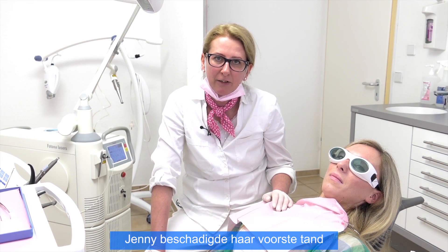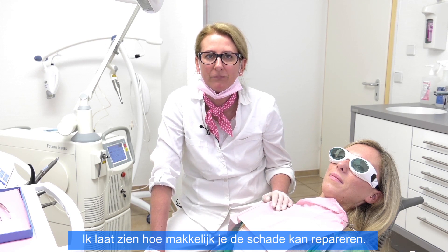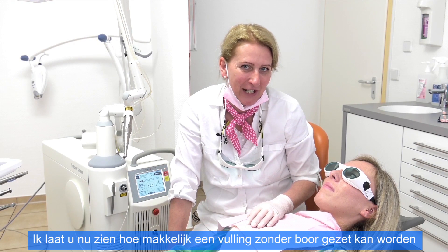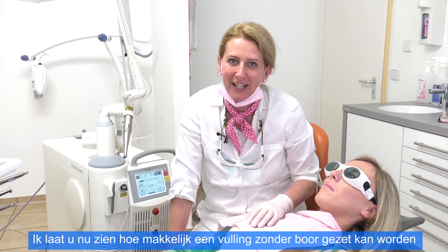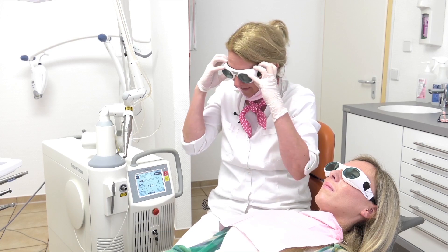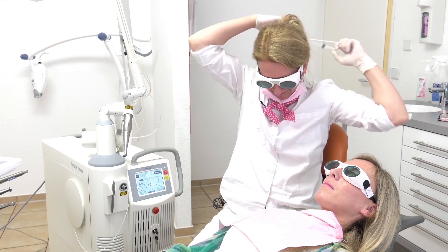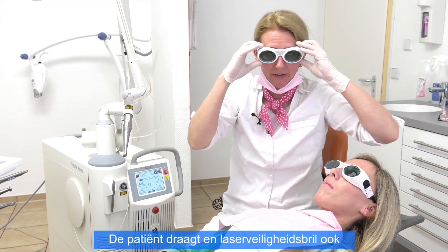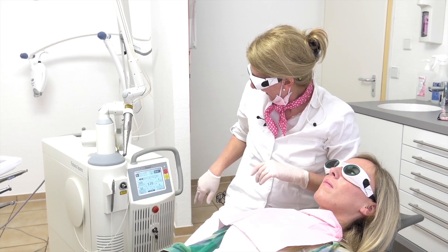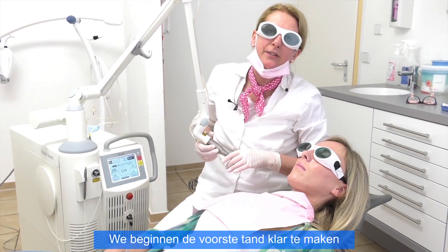Jenny damaged the anterior incisor and I will show you how easy you can fix the damage. We took a picture before starting with the treatment, and I show you now how laser preparation on incisors works. First of all we have to use our laser safety glasses. The patient is wearing safety glasses as well. The laser is now active and we start to prepare the incisor.